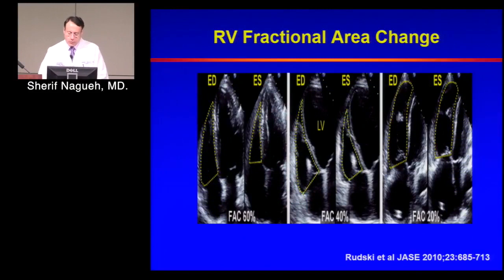So we're shifting gears from simply dimensions and sizes now to systolic function of the right ventricle. We are familiar with end diastolic volumes and systolic volumes. For the RV, if you're working 2D, not 3D, we talk about end diastolic area and end systolic area. As you can see, it gets part of the right ventricle, but not the whole right ventricle. We haven't shown you what happens to the RV outflow tract area, for example.